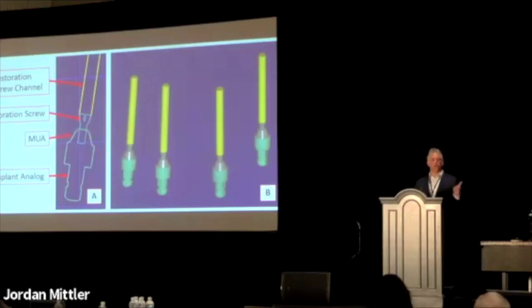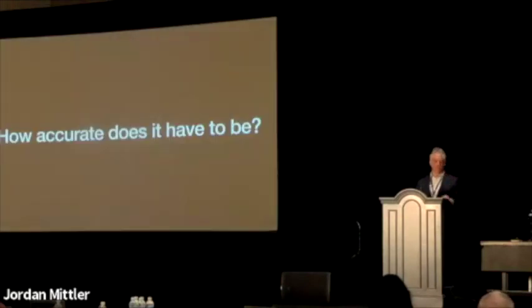If we did not have photogrammetry, I call it the enabling technology because it has enabled and opened the doors for digital workflows. If we didn't have this, or the ability to count on it, then we'd be stuck with the old ways, right? And we'd still be mixing analog and digital. Now there's no true digital workflow, but the point is that it has opened the door for digital workflows. And I want to point out that it's just one record. I'll get into that here in a second.